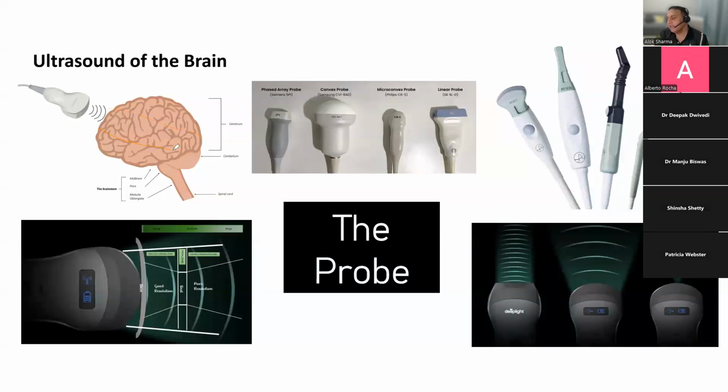Now, this is really important, and this is where the concept of gain comes in. We know that when ultrasound waves penetrate the brain, as you can see over here, waves come back to the ultrasound probe.